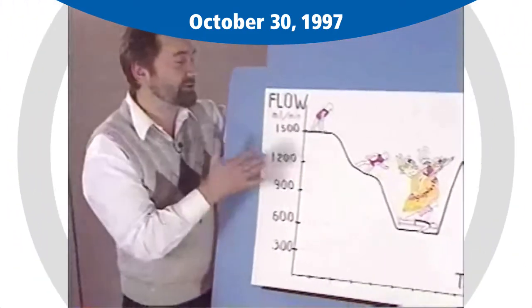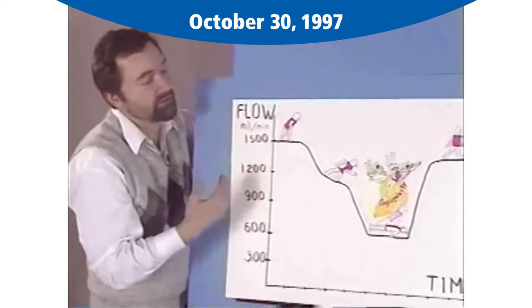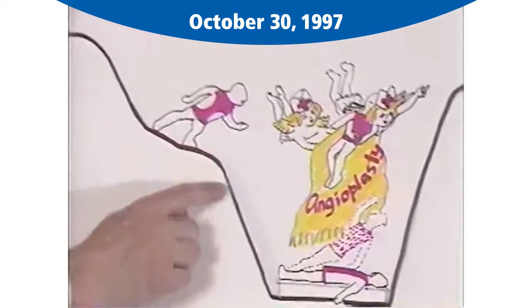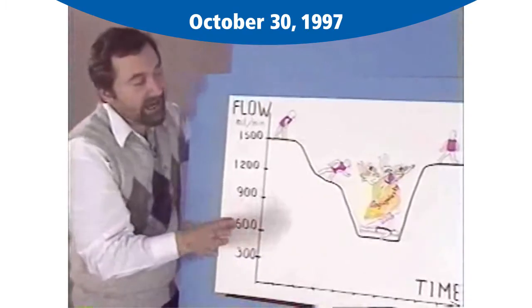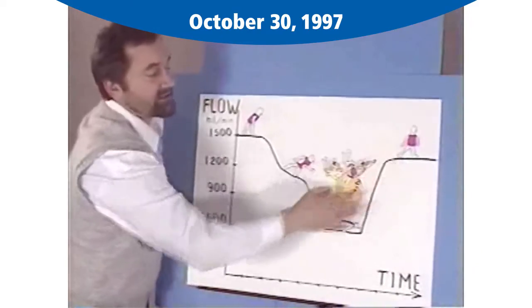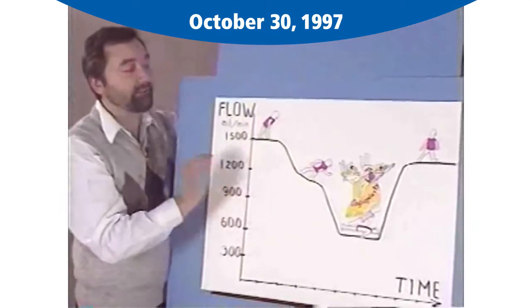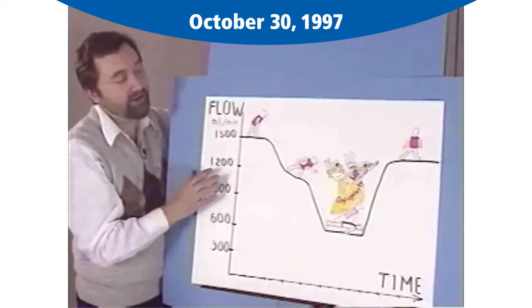And this is actually the main idea of this technology. It's a trend. It's measuring the access flow, let's say initially, maybe as soon as you put in this vascular access, or at least later, and then following it up in time. And if we see that the vascular access flow starts going down, we should do something, because for sure this patient will clot. So at least now we see in publications that early intervention at this stage can save this vascular access for a longer time. And again, I think this is the main point of this technology: monitoring the vascular access flow and making an intervention at the right time. In this case, we can prolong the life of the vascular access.